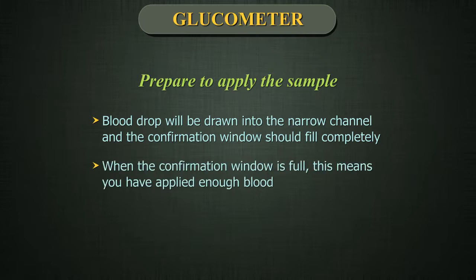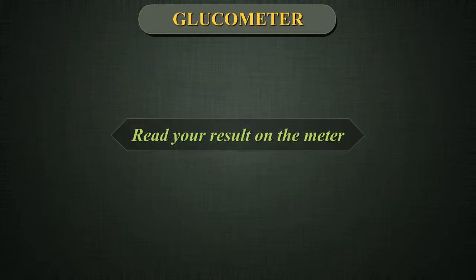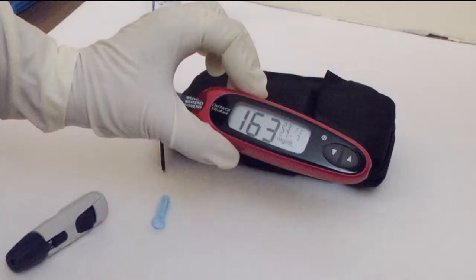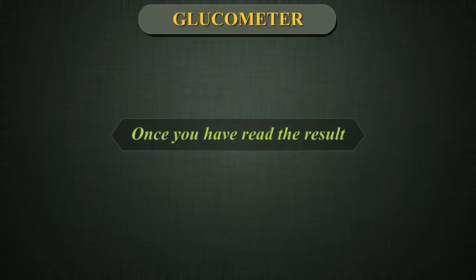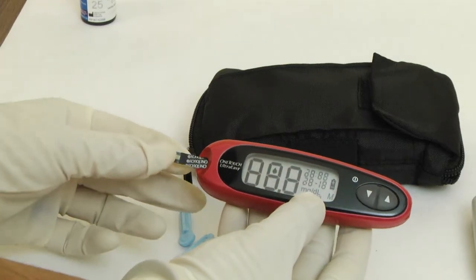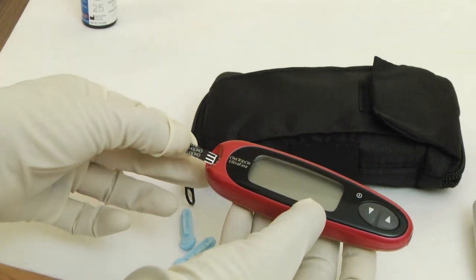The blood drop will be drawn into the narrow channel and the confirmation window should fill completely. When the confirmation window is full, this means you have applied enough blood. Read your result on the meter. The blood sugar level appears on the display along with the unit of measure and the date and time of the test. Blood sugar results are automatically stored in the meter's memory. Once you have read the result, you may turn the meter off by removing the test strip.